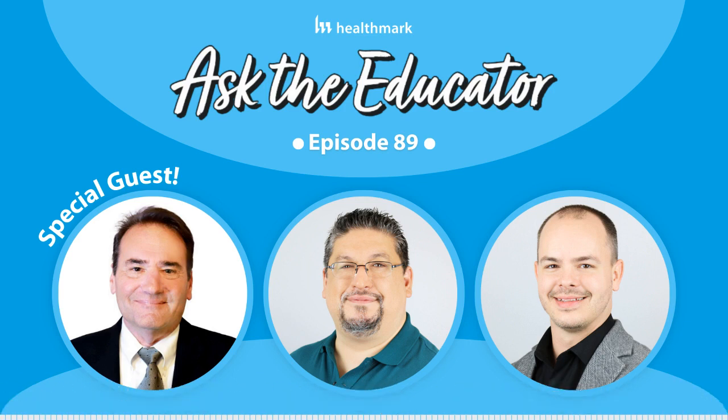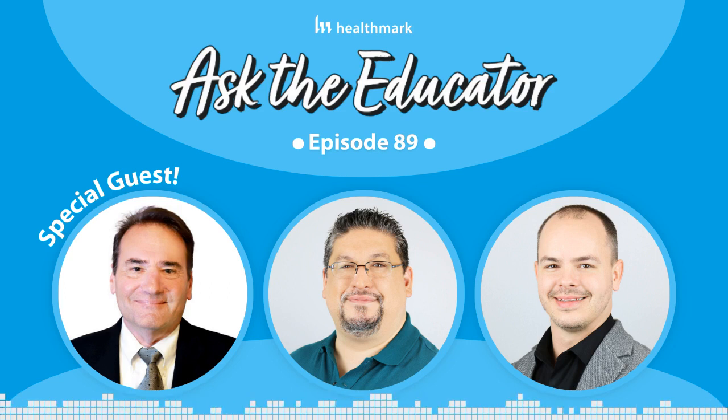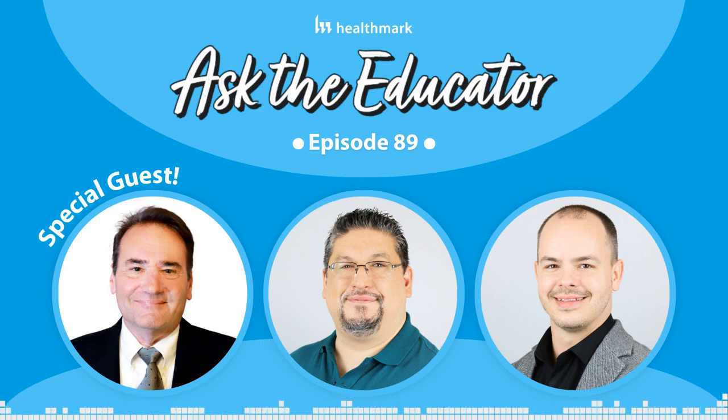So the big thing is that, first of all, the test soil that you use should be clinically relevant, so you have to demonstrate that. The test soil you're using simulates the actual clinical soil that a device will come in contact with, and there's a lot of steps involved in that. You're going to evaluate it based upon not just the composition of the soil, but also how sticky it is, if you will, its adhesive qualities when it dries out. Does it dry out in a similar way to the soil on the device? Where does it flow on the device? All those things have to replicate what happens to the clinically used device. So that's one of the big innovations.